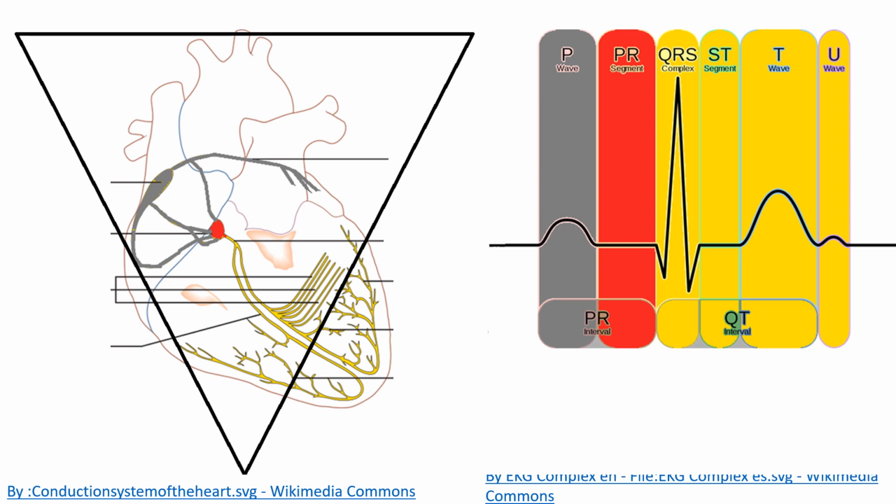Anyways, what happens in a person that needs atrial pacing is it's looking like this. 1, 2, 3, 4, 5, 6, 7, 8, 9, 10, 11, 12, 13, 14, 15. Oh, fire, right? Well, that's too long, right? Your heart needs to pump faster than that. And so what we do is we actually go in and heal with steel. We're going to put a pacer in there. So we're going to put something that's going to be kind of a circular device here, and we're going to hook wires up to your heart because your heart's not working very good.